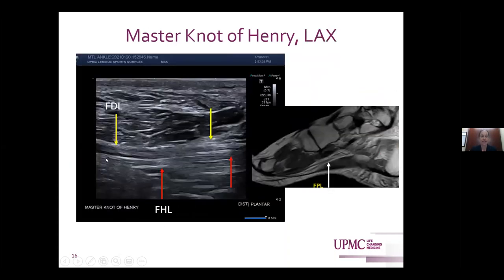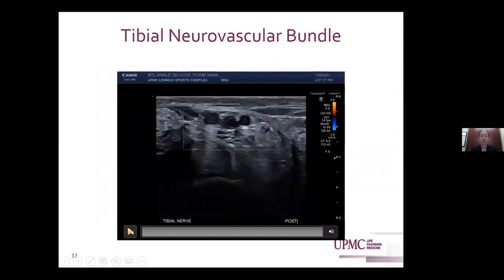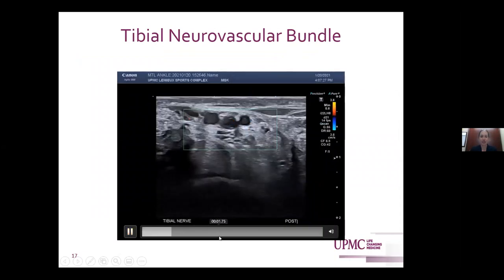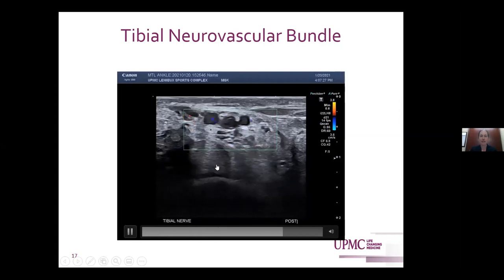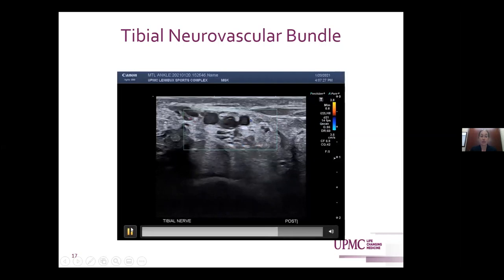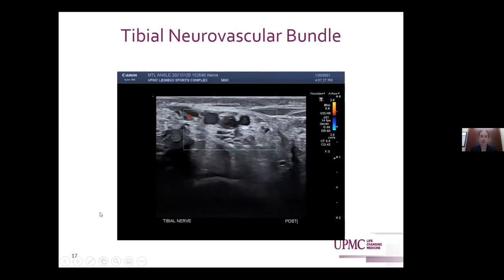Here it is in long axis — we see FDL over FHL and the same correlate on MRI. Moving on to the tibial neurovascular bundle, this is a better image of our tibial nerve: a nice honeycomb hyperechoic structure with the tibial artery overlying it, flanked on either side by the veins. When looking at veins versus arteries, you can use compressibility as well as Doppler flow.